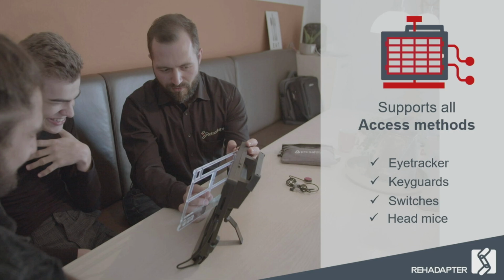So with our individual keyguard service, the only thing you need to do is take a screenshot of the specific app that you would like to access, send us the screenshot, and provide us the information about which Rehadapter you would like to use the keyguard system with. We only need to know the specifics about the shapes, the sizes, or the fields that we should produce inside these individual keyguards.